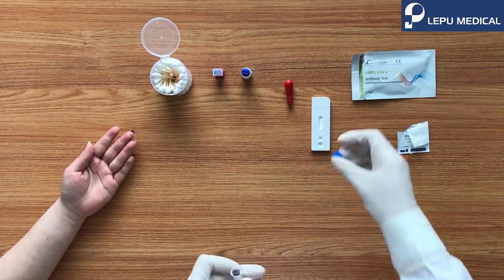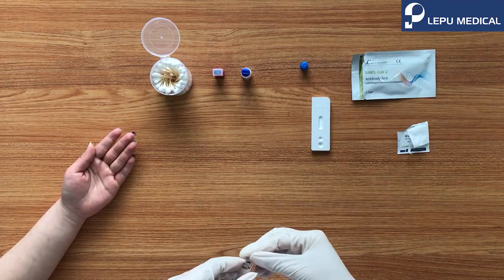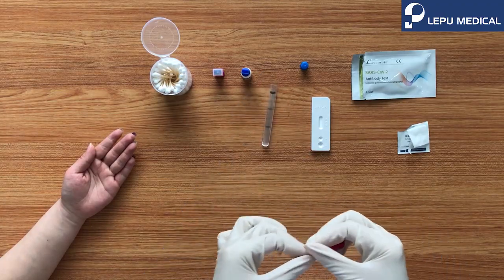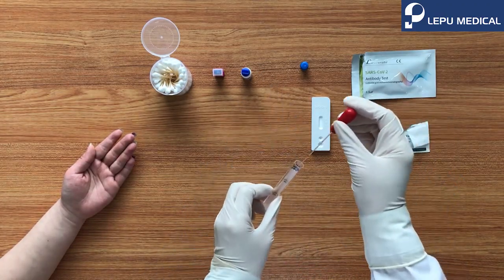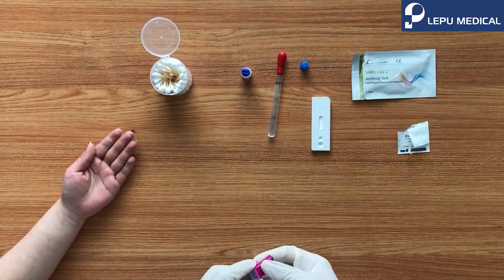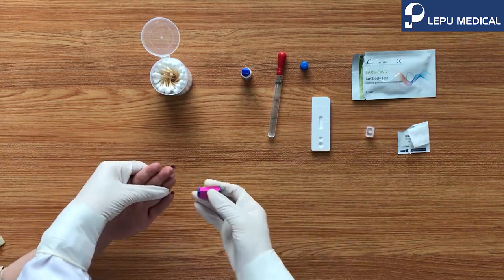Prepare the dropper. Take one pipette from the container and connect with the dropper head. Uncover the lancet, attach the needle side to the finger, and press to the end.